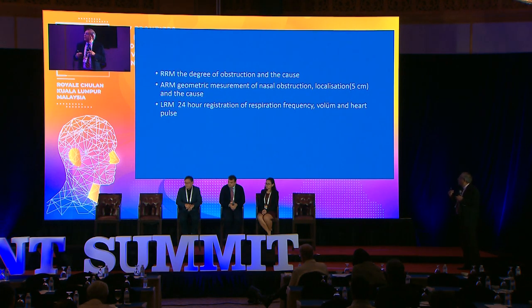So, rhinomanometry shows you the degree of obstruction and the cause. Acoustic rhinometry gives you the geometric measurement of nasal obstruction and localization of the obstruction within the first 5 centimeters. And long time rhinometry is the 24-hour registration of respiration frequency, volume, and heart pulse.